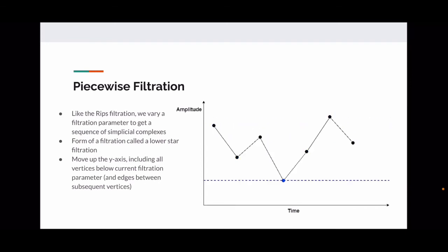So like the y-axis, that's our filtration parameter. Okay. And then the x-axis of the barcode is the filtration parameter. So it tells you how long the zero-dimensional holes last. Wow. A zero-dimensional hole is just like, is it connected or is it not connected? If it's connected, okay, that's a zero-dimensional hole. Or yeah, I guess connected components is a better way to phrase it.